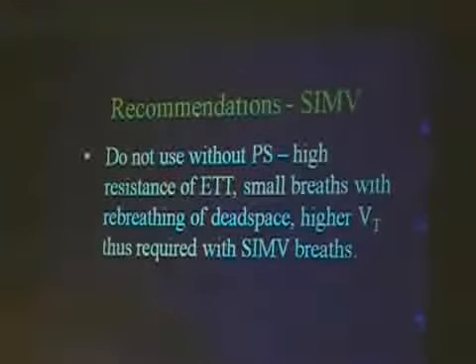A couple of recommendations with SIMV. Pretty much nobody is using SIMV anymore without pressure support. The problem is that the baby's trying to breathe in between the breaths. He's got a high resistance of the endotracheal tube. He's rebreathing dead space, and higher tidal volumes are needed. And you can see a nice graphic representation of that in Marty Kessler's article, which is the first reference there. So if you're going to use SIMV, that's why we do it: because that baby needs to be supported on the breaths that he's breathing in between the SIMV breaths.